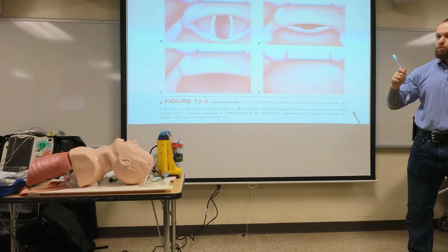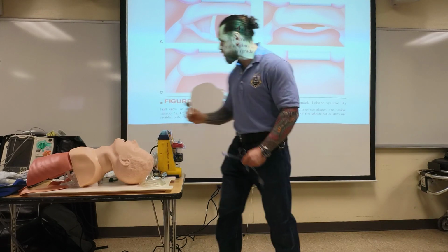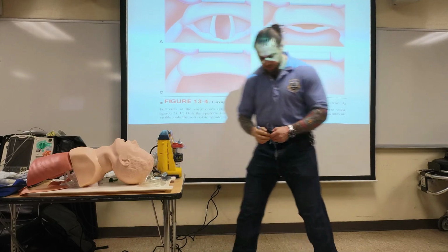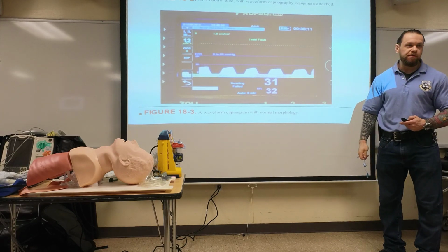We're going to go structure by structure. You're not going to jam the blade all the way in. You're not going to go all the way in and lift. You're going to go structure by structure. We're going to find the epiglottis, and so on. I'll explain all this. And so lung sounds, end-tidal CO2, and pulse ox are your confirmation markers.